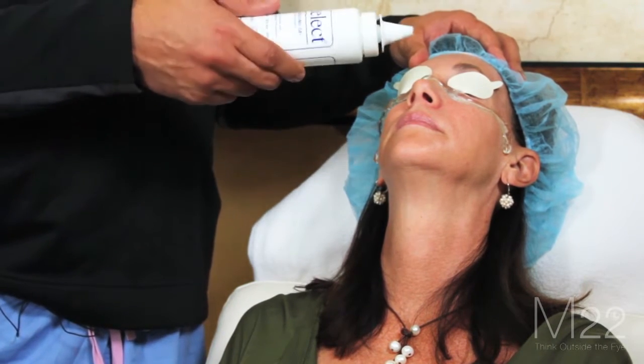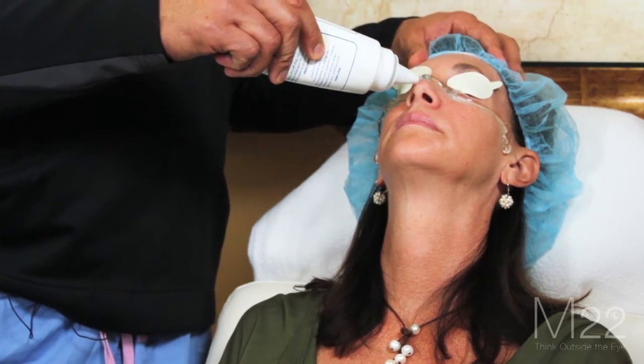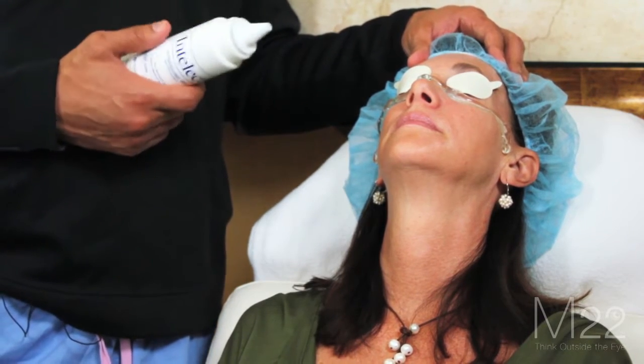We're going to do one pass from ear to ear, including the nose. Then we're going to do a second pass. What we found is that with the double pass method, we get the best results.